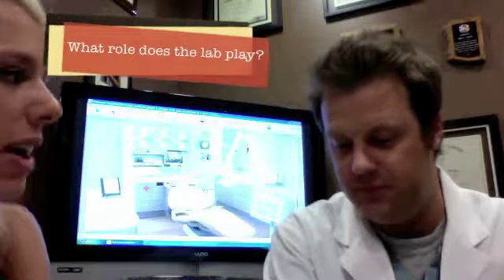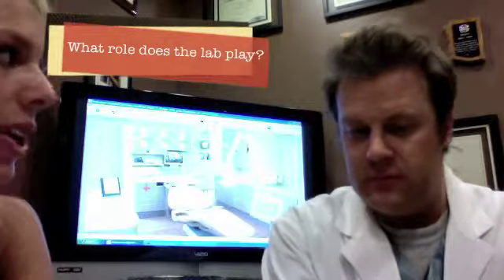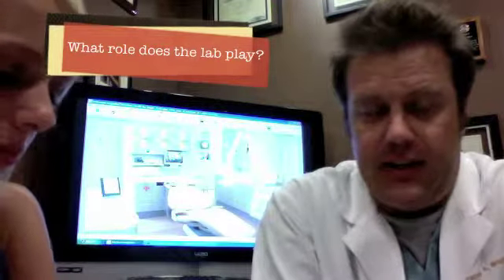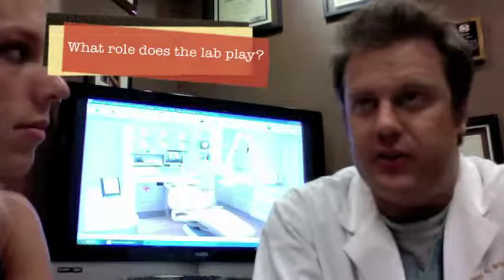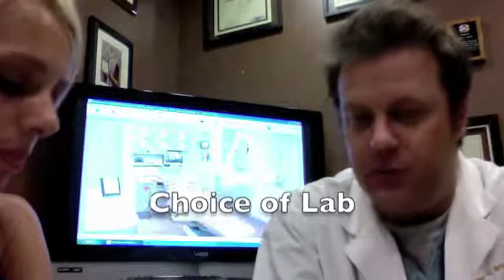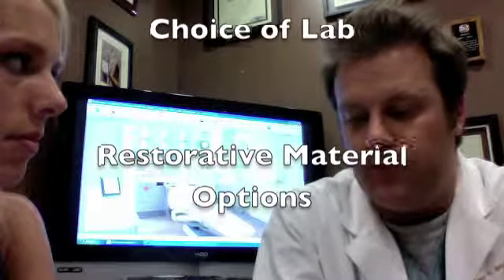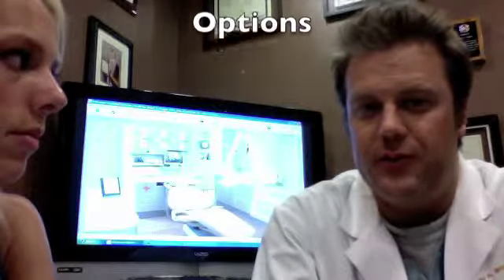And I know that you have certain parts of the procedure that you do here in your office, but what role does the lab play in making the iTero system useful for your practice? The iTero system is unique in that there's other CAD/CAM software that we use in dentistry, be it the E4D or the CEREC, where we actually make the restorations in the office. With the iTero, we can choose what lab we want it to go to. So instead of just being able to make the restoration out of one material, we can have it made out of gold or porcelain over gold or any material that we choose.